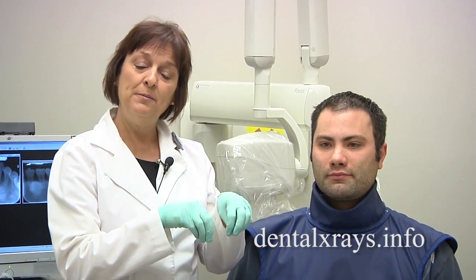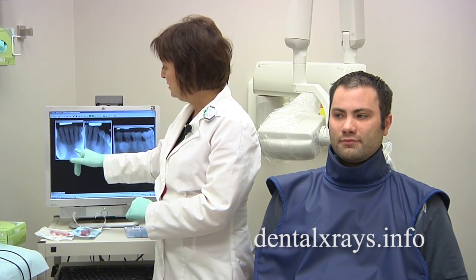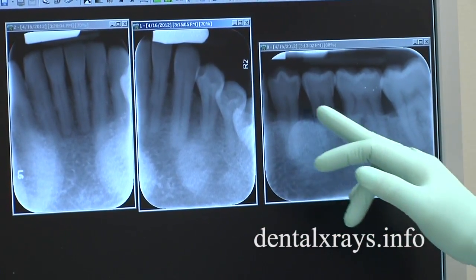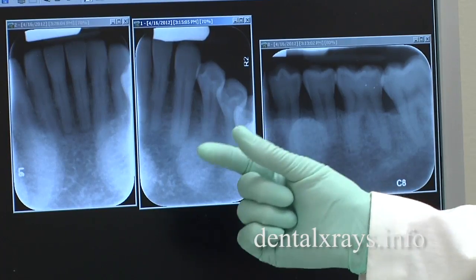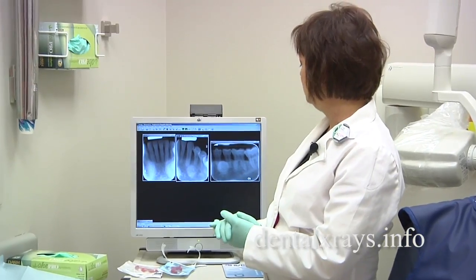What is a tori? Five to forty percent of patients have them. They aren't anything to be concerned about — they're just extra bone that some people develop in their mouth. A lot of people don't even know they have them, but we do when we have to x-ray them. If you look over here, you can see these radiopaque areas on our films. These are actually that extra bony growth, and it's projected on your film as a little bit more dense area, so you won't be able to eliminate this at all on your films when you're taking them.